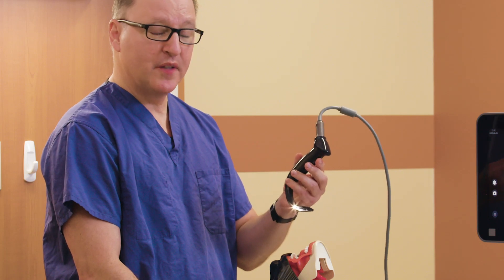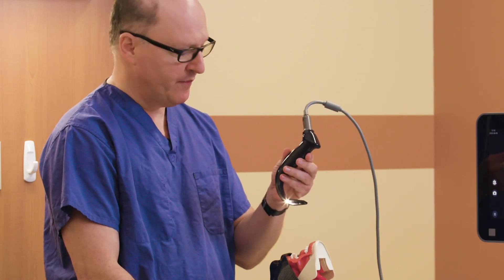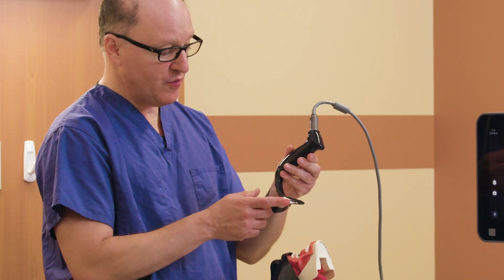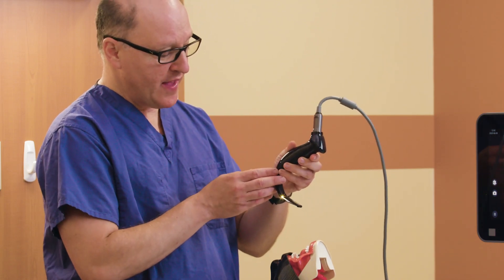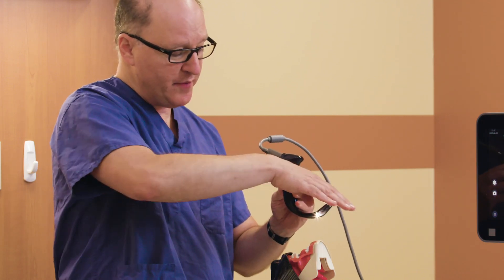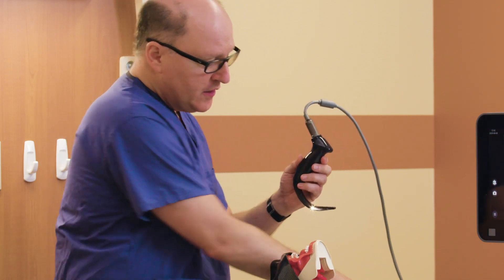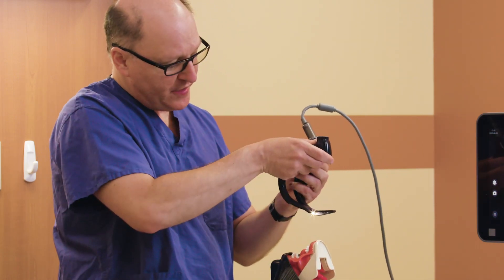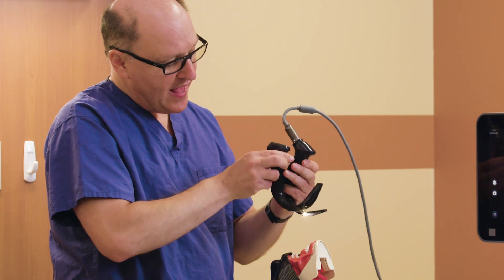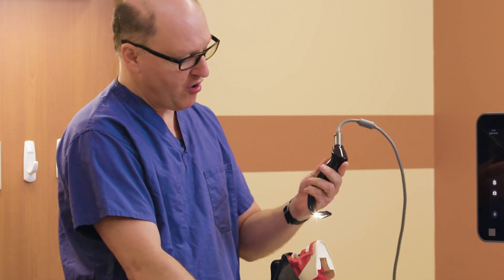When using a hyperangulated blade, I find for most adults the three is more than adequate. It is important to appreciate with hyperangulation that if we over-accentuate insertion with the trachea coming down, our tube delivery gets harder. Sometimes people will take the four and over-insert it, and that up-angulation will actually make tube delivery harder.